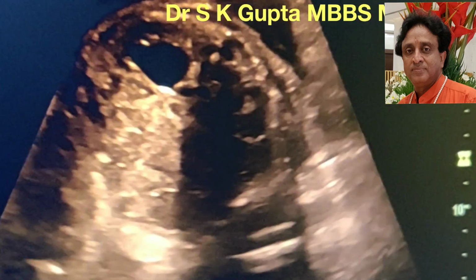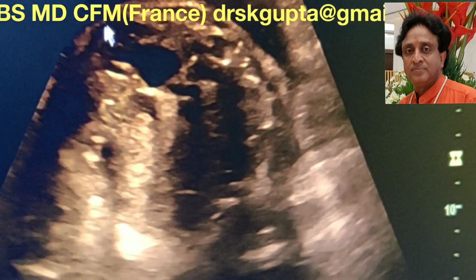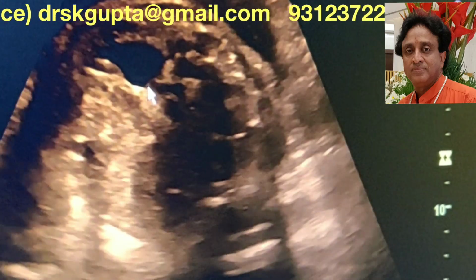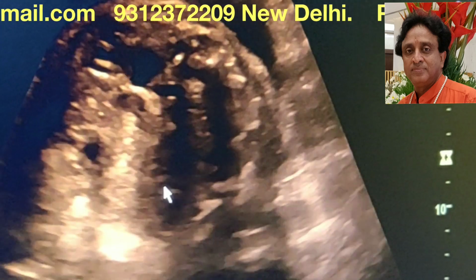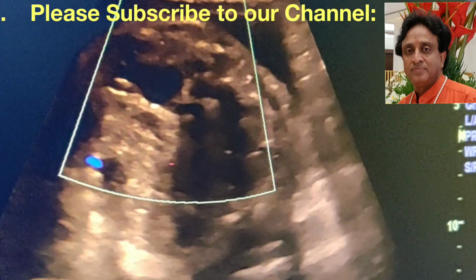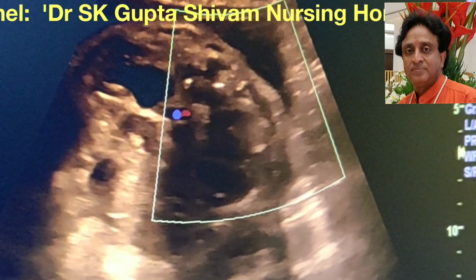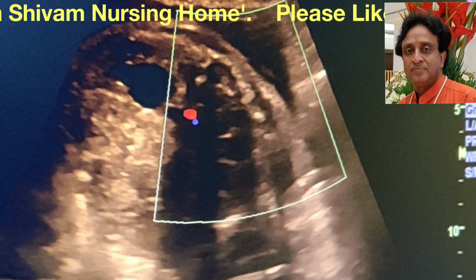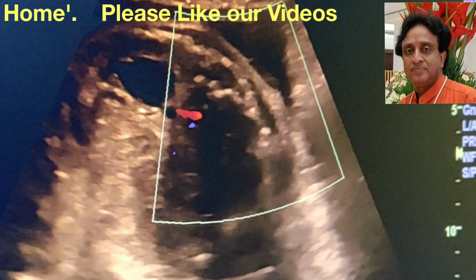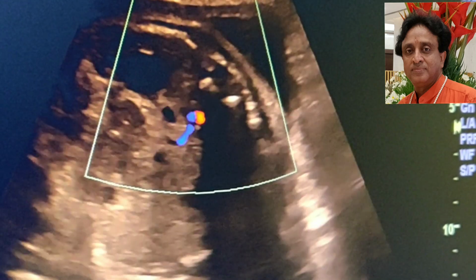You see, this is the kidney outline. I try to show you this is the kidney outline on the right hand side, and this is the kidney outline on the left. And if I put color into this, you can see some color being taken up by the right kidney. The left kidney is not taking much color. I decrease the color gain. It appears that the renal vessels are being seen.